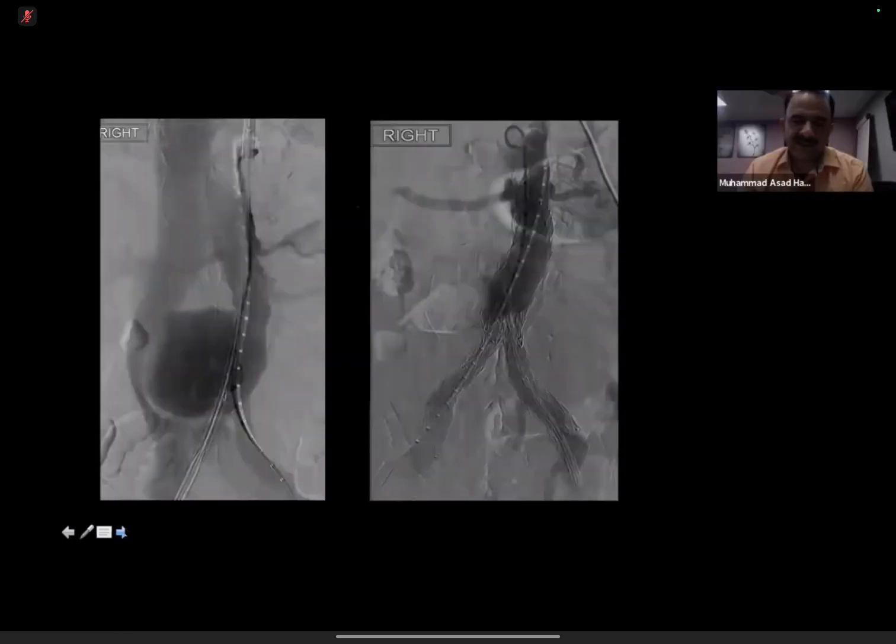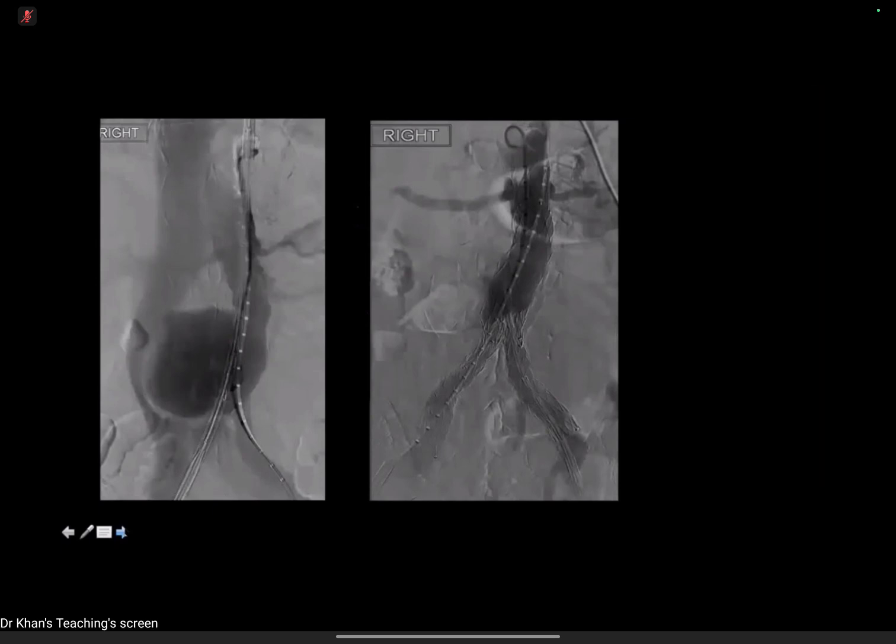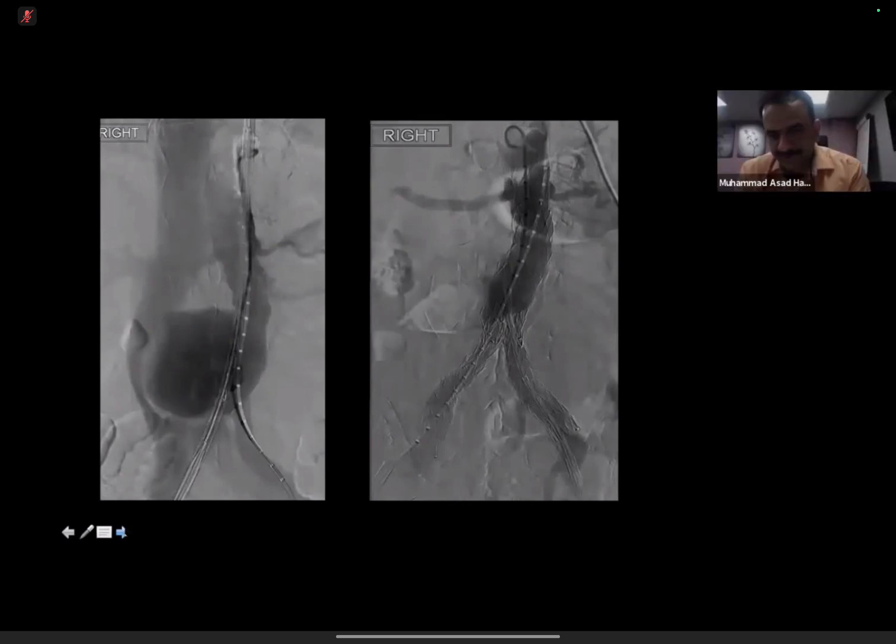Now, this patient has had a procedure performed. Can you please describe what procedure has been done? They look like they have an aorto-bi-iliac stent inserted. So they've had an EVAR procedure performed. Good. So endovascular aortic aneurysm repair, i.e. EVAR, has been performed. The aortic aneurysm sac has been isolated. Once you isolate the high pressure circulation from the low pressure circulation, that normally resolves the problem. Okay. Let's go to the next case.